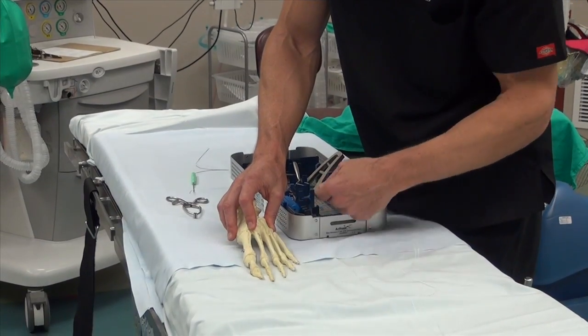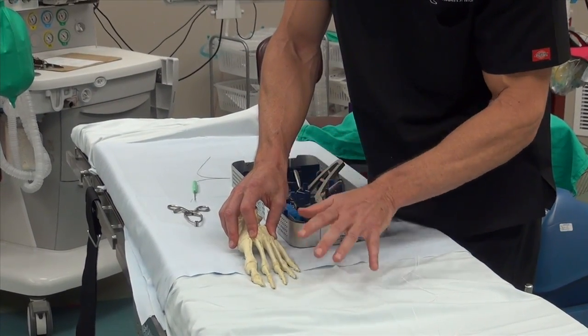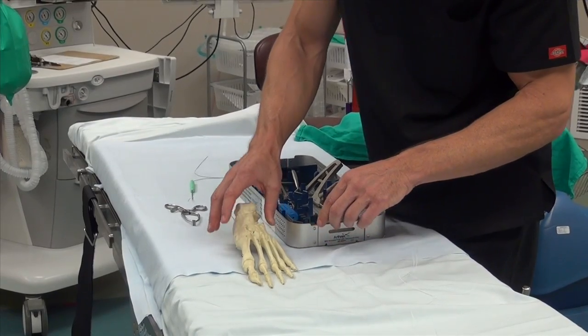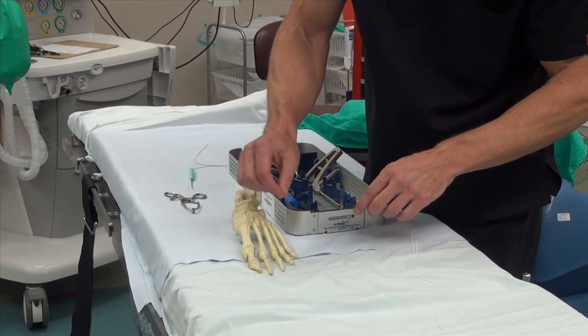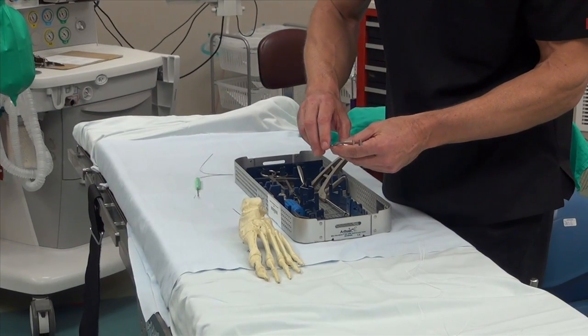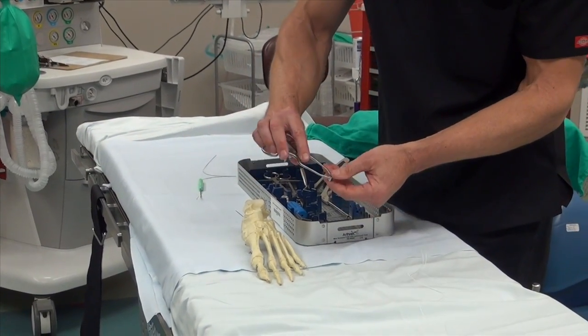In the old days we put wires in them, we put joint implants, we did everything to fuse the joint and the toe up in the air. But now we can recreate the collateral ligaments on the side and pull the toe down with this kit. The difficulties about fixing this have been avoided with equipment from Arthrex.